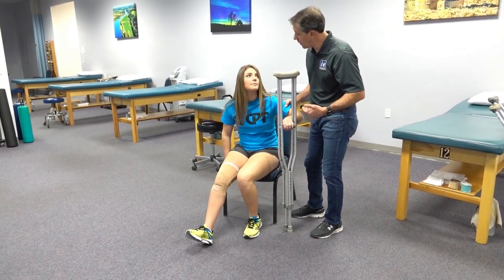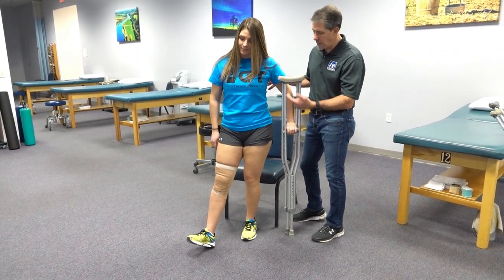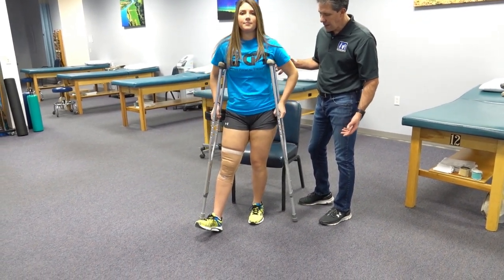On the count of three we're going to go up to standing — one, two, three — good. And then you would take one crutch, bring it over to the other side, and then you're ready to go.